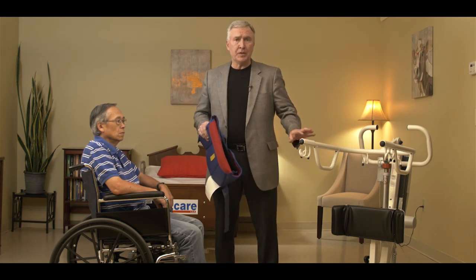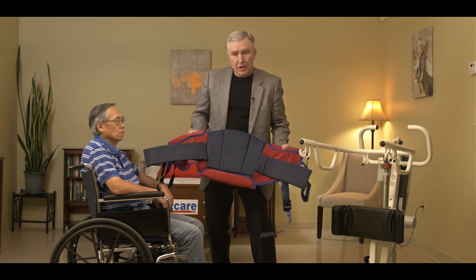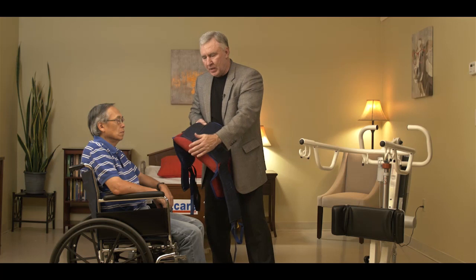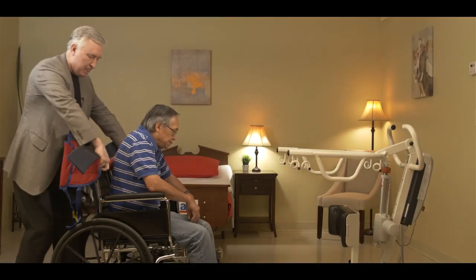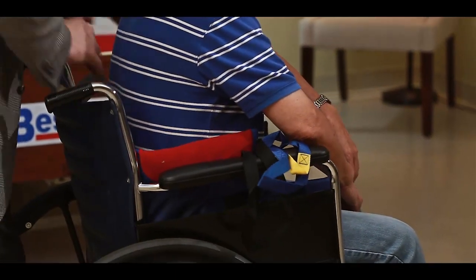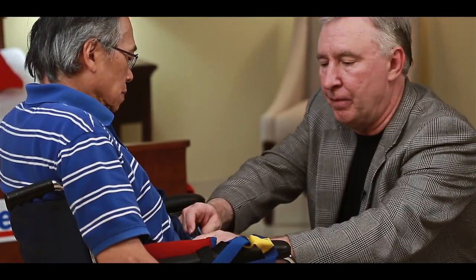Now that you understand how to operate the lift, let's go ahead and show you how to lift a patient. The stand-assist sling is shaped with an additional support strap in the center and a cushion at the bottom. That cushion is what lowers down behind the patient in the lumbar support area. So when we place it on the patient, we lean the patient forward slightly, tuck the sling down behind them until the lumbar support is touching the chair, bring the support strap around the person's waist, buckle it, and tighten it so it's nice and secure.